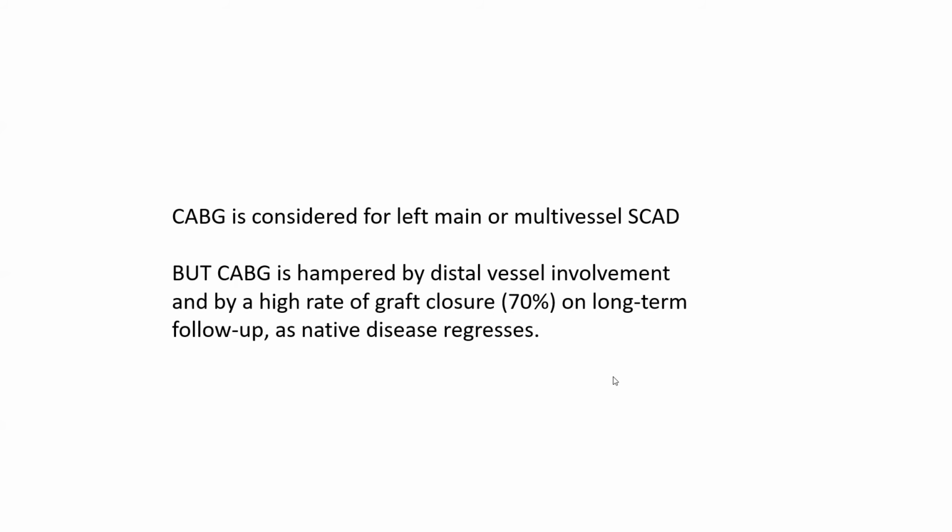And I agree with Dr. Rassen's point. A lack of tortuosity does not rule out SCAD. In the literature, I showed you 78% of SCAD in the registries had tortuosity. So not all have it. But to me, if you don't have tortuosity, you may have SCAD, but I'm more willing to do IVUS or OCT and take a risk to prove the diagnosis.